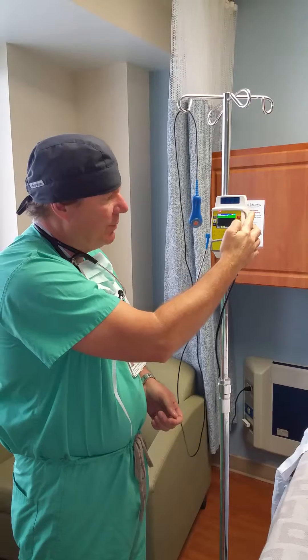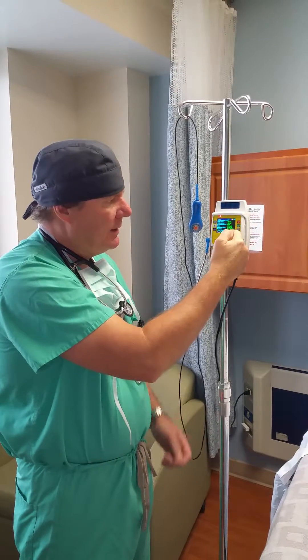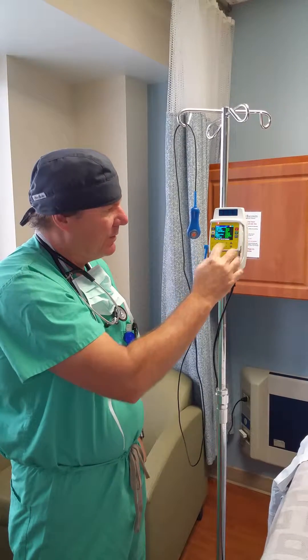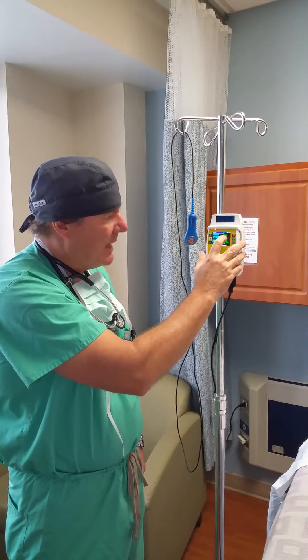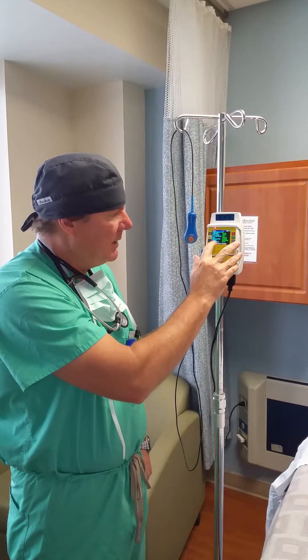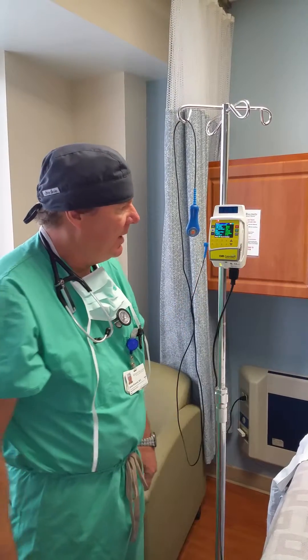You'll select the protocol — is this a new patient? Yes. We're using ropivacaine 0.2%. We have a 200cc bottle of ropivacaine. It took 10cc to get through the priming, so we have 190 milliliters left. We're running it at 10 milliliters an hour with a maximum rate of 15, and a patient bolus of 5 milliliters every 30 minutes.